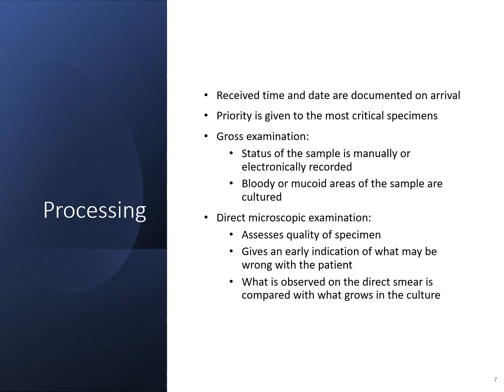Priority is always given to the most critical specimens. So for example, a spinal fluid is always considered a very critical specimen, and so those are usually processed right away, as soon as they come into the lab.